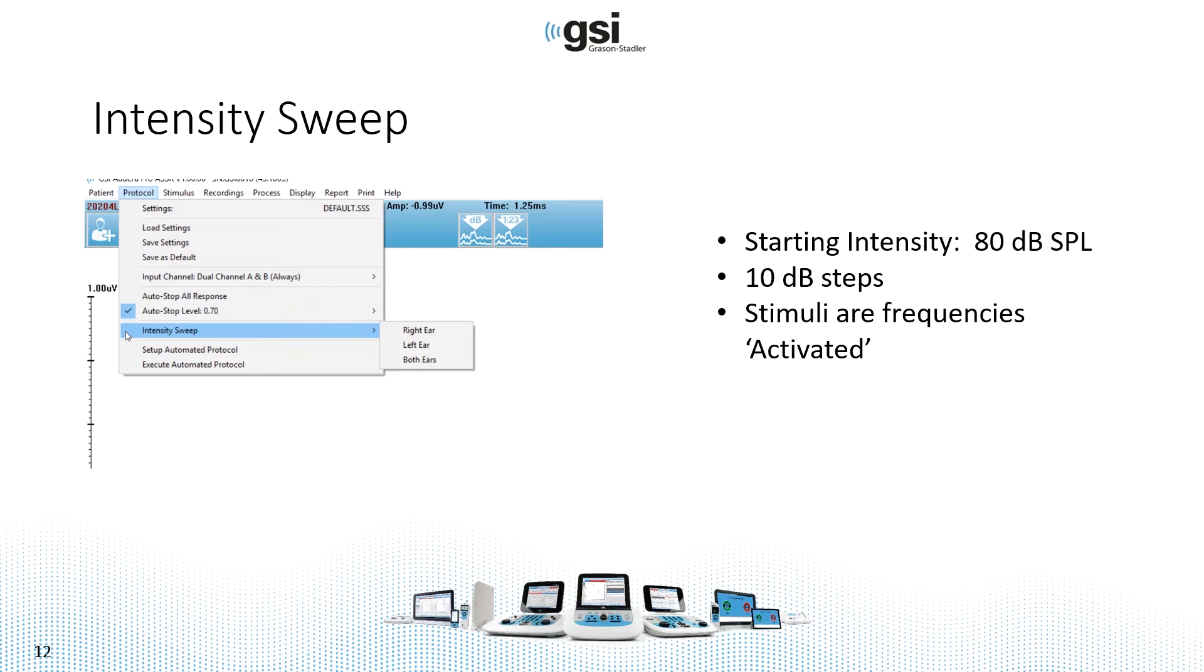So to do the intensity sweep, you would go to the protocol drop down, select intensity sweep, and select right, left or both ears. As soon as you make that selection, the test is going to start.